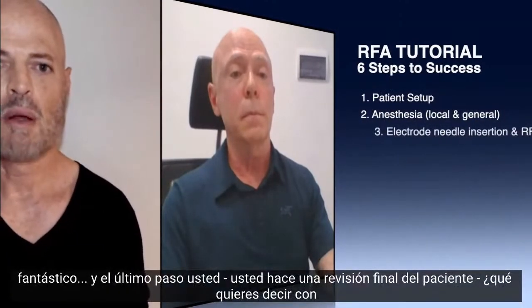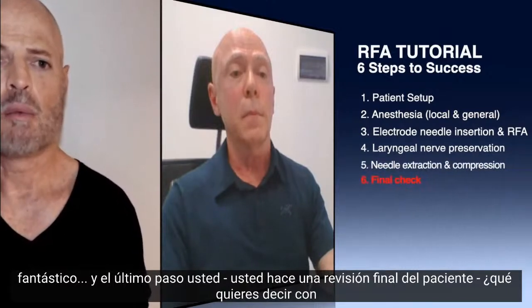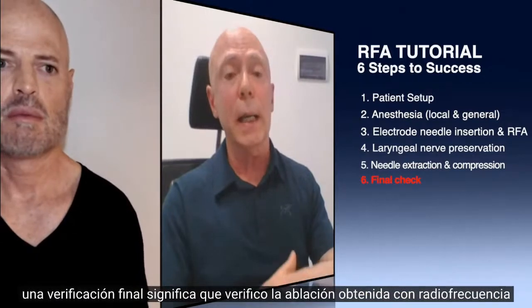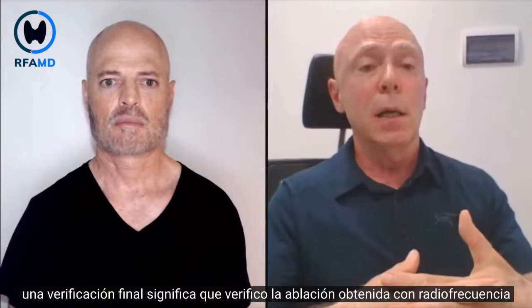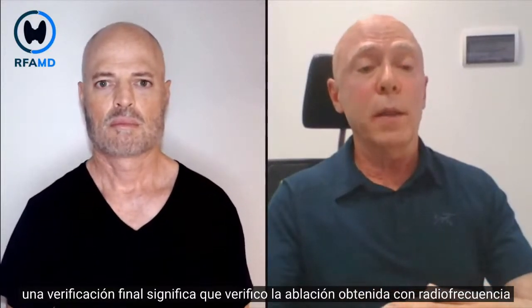Fantastic. And then the last step, you do a final check of the patient. What do you mean by the final check? A final check means that I check the ablation obtained with radiofrequency.